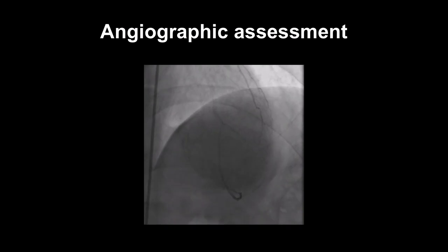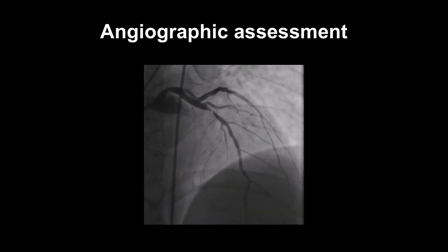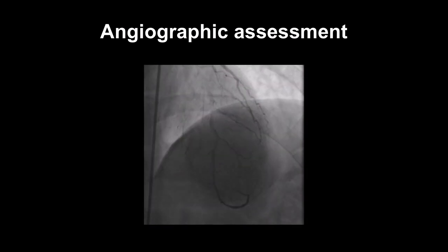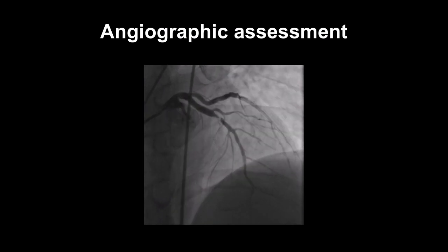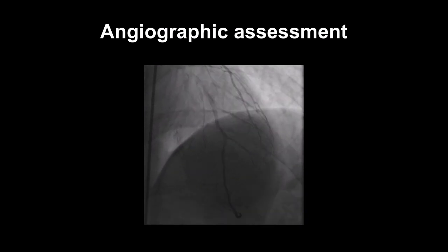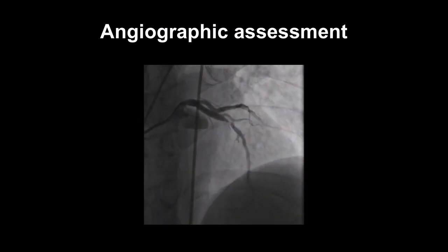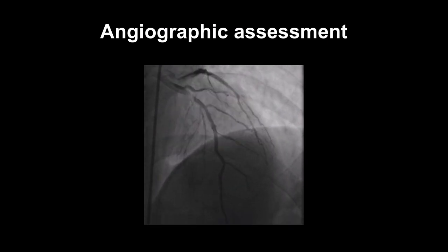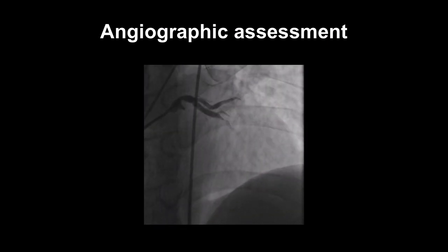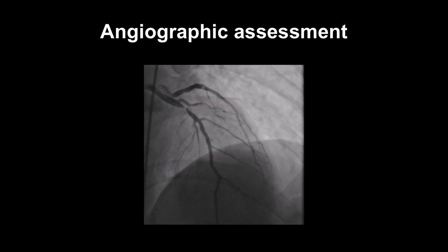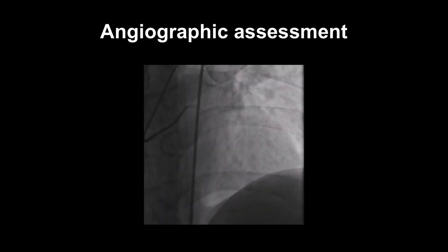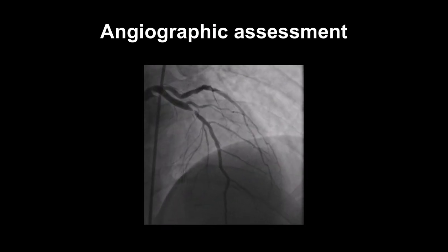Assessment of lesion severity is often very subjective when evaluated by clinicians performing angiography. We often tend to eyeball the severity of the stenosis. This is usually reasonably accurate if the lesion is severe, as in the example shown, but tends to get more subjective as the stenosis becomes less severe in the mild to moderate range.